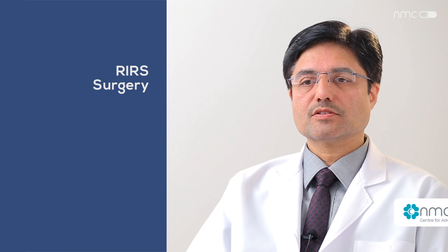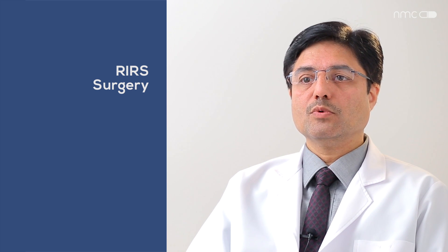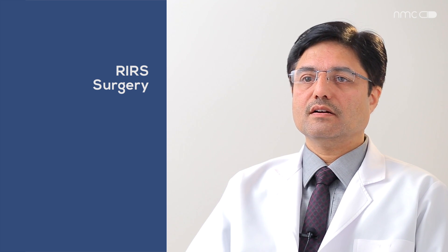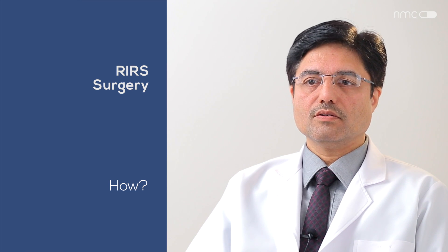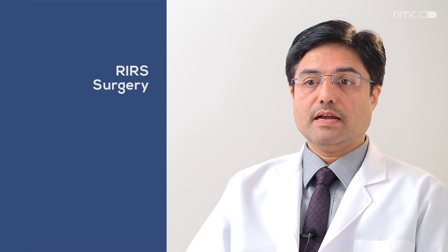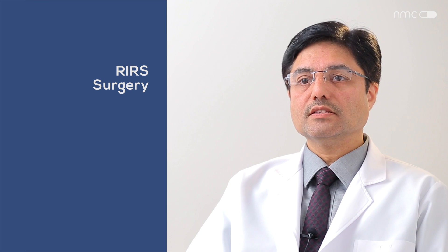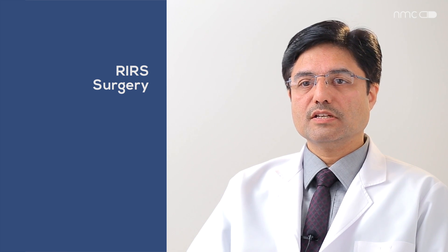This flexible scope has flexion available at the tip in both directions — it can flex up to 270 degrees on the right side and 270 degrees on the left side. By rotating the scope, the surgeon can see the whole kidney, all the calyces, and manage almost any stone. If there is a small area holding the stone, we can cut that area with the laser to deliver the stone out.